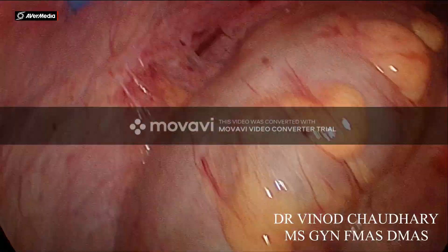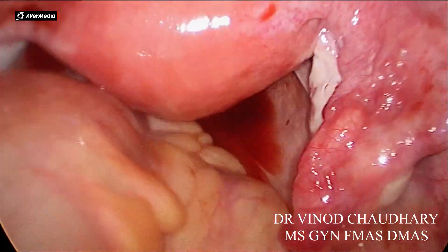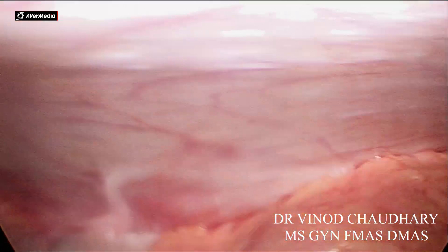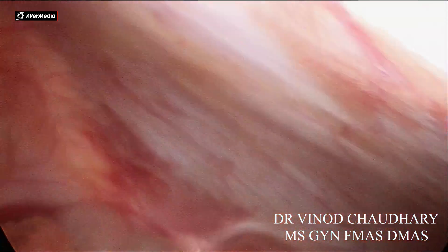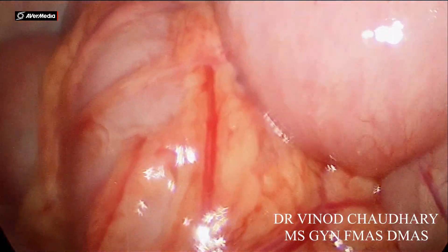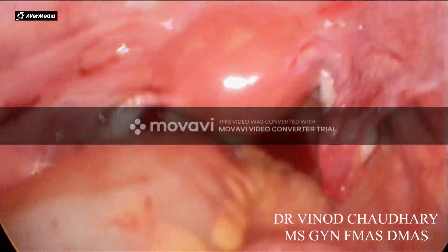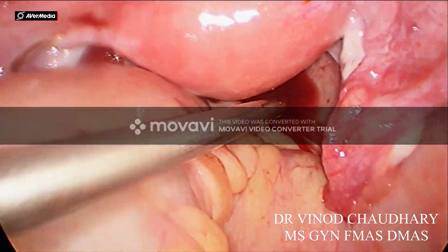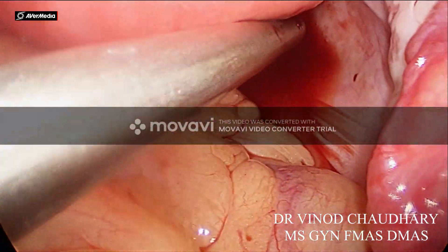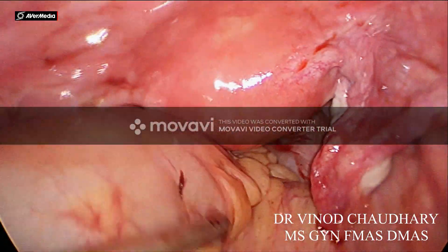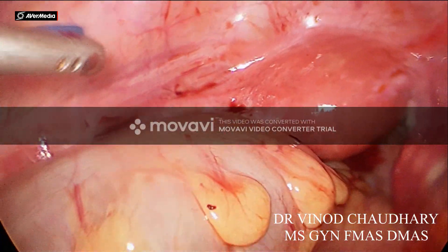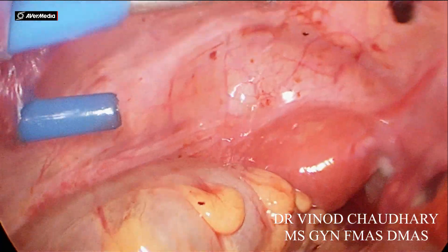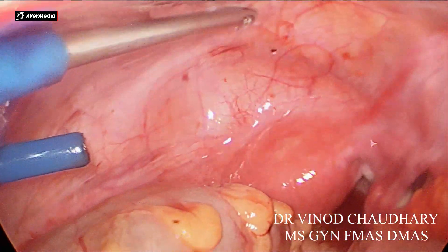It is almost over now and we are just cleaning the paracolic gutters. We are watching the liver and all those areas. The surgery itself was almost a one-minute job, but the suction part took very long.